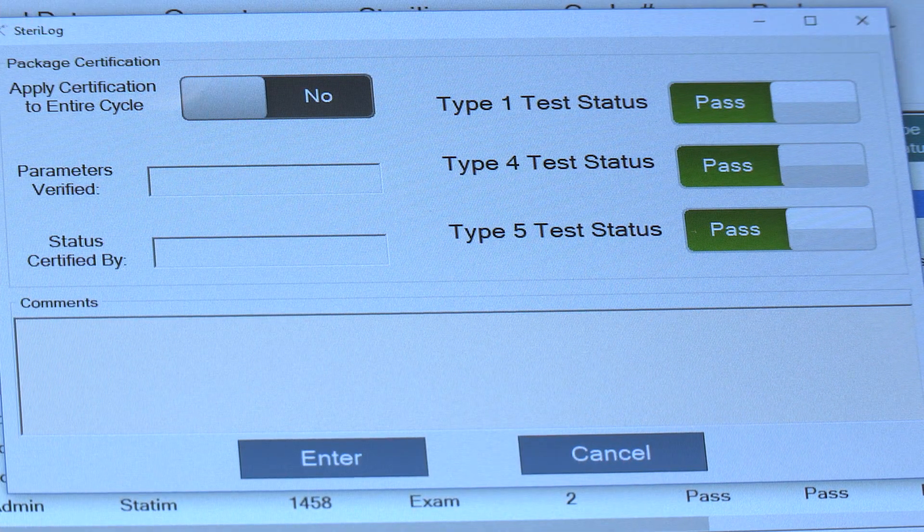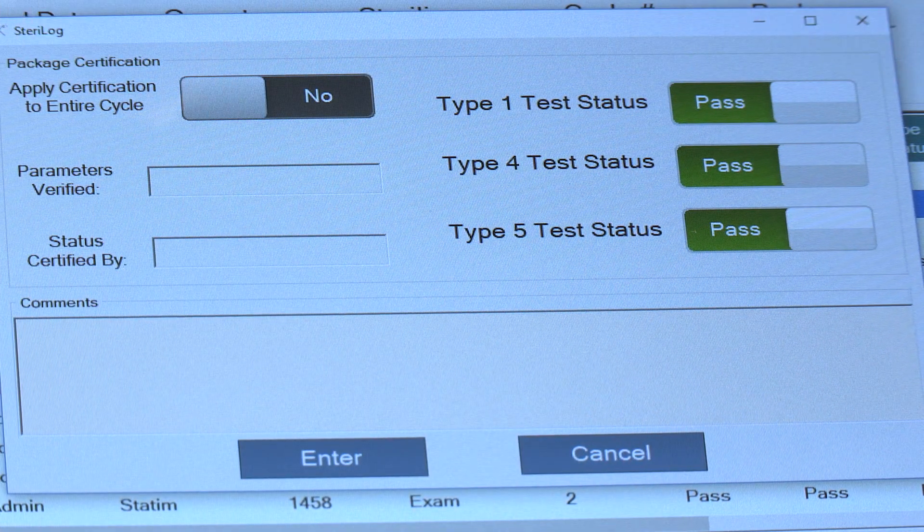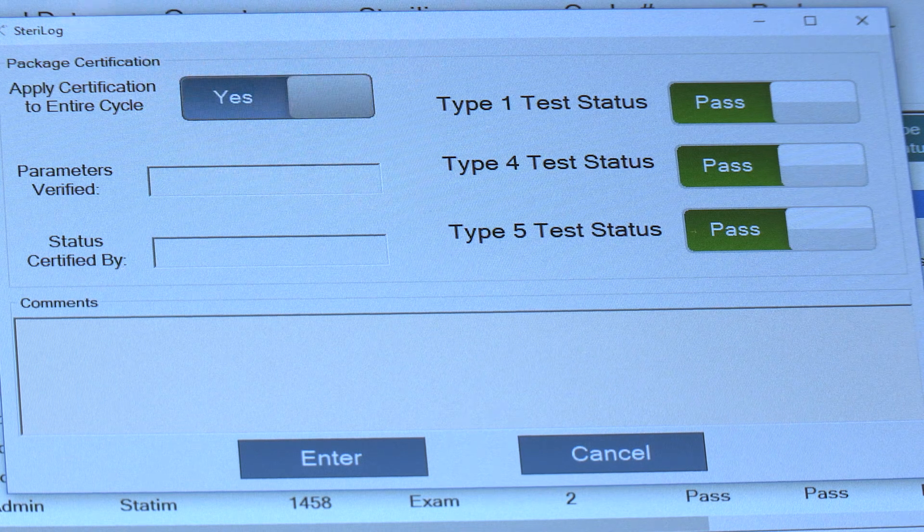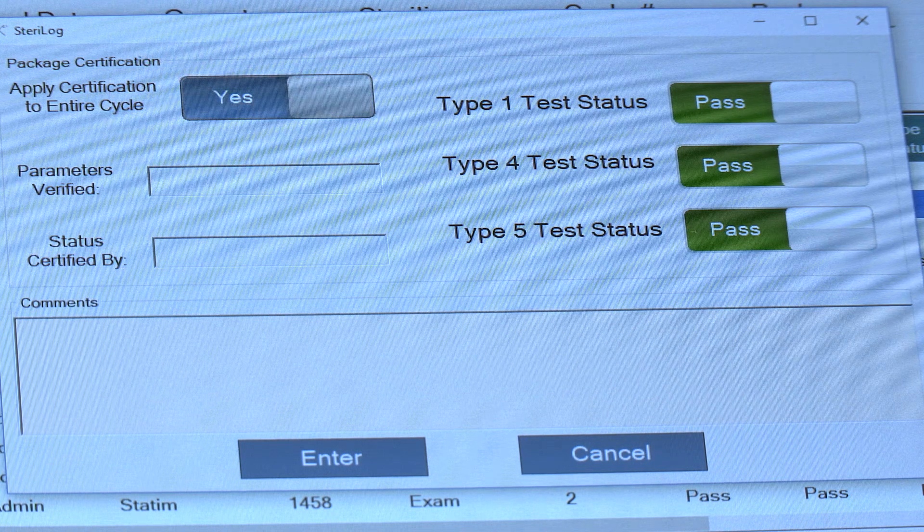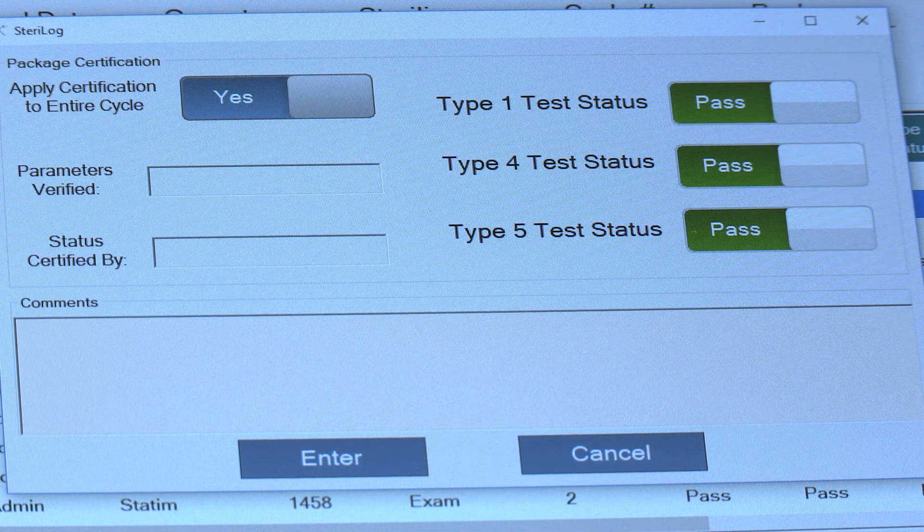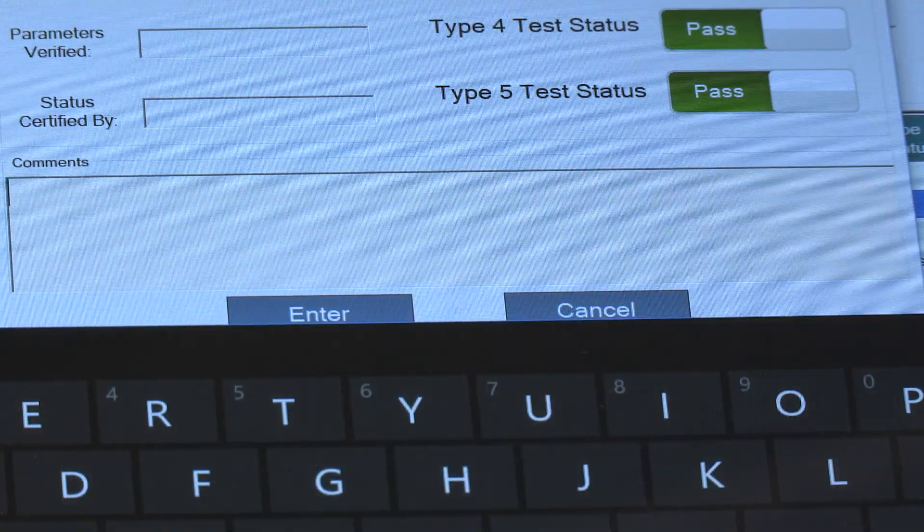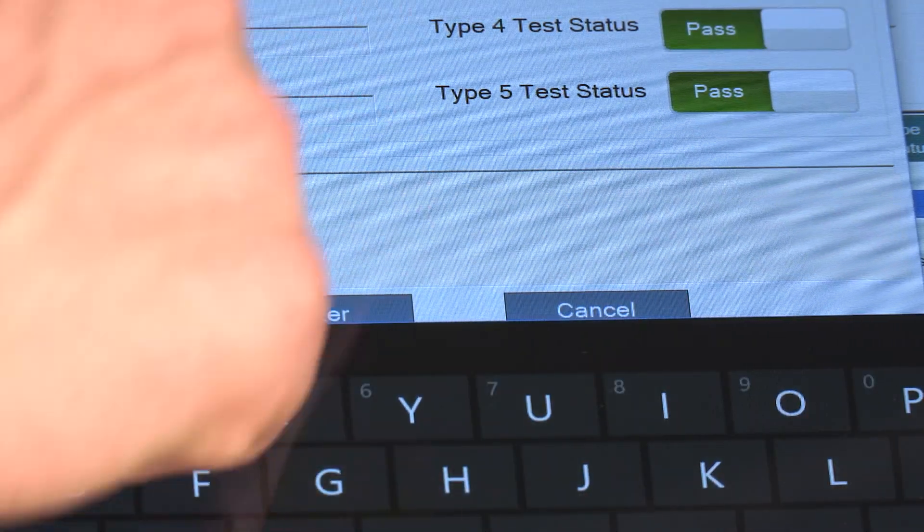You can certify the entire cycle in one shot provided that you've checked all your chemical indicators, and you can add comments into this comments box as well.